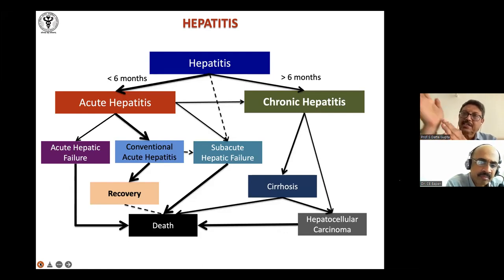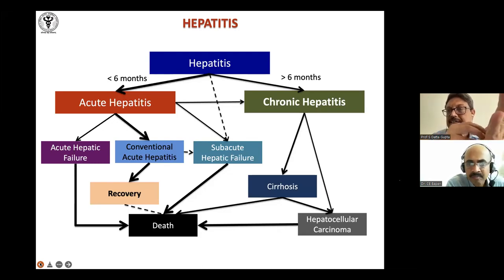From the portal tract, if there is fibrosis going here and there, or for example around the terminal hepatic venule, the collagen is very little, just a thin line around the vein. On the other hand, in alcoholic liver disease or in Budd-Chiari, you'll find a lot of this collagen laid there. So that's how it helps. That's why we do both.